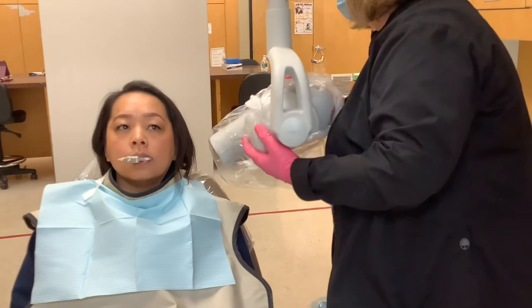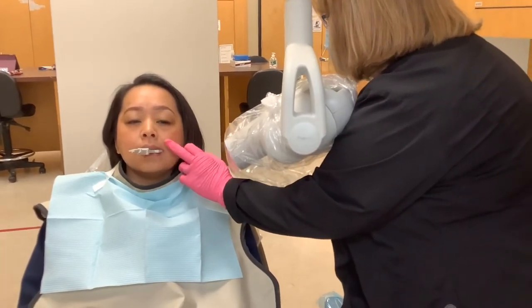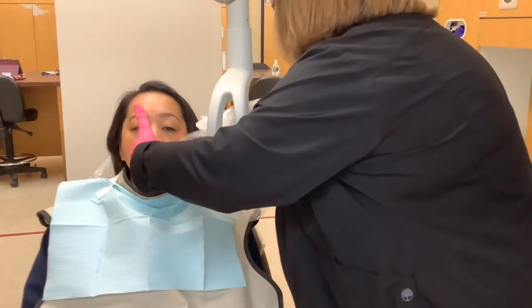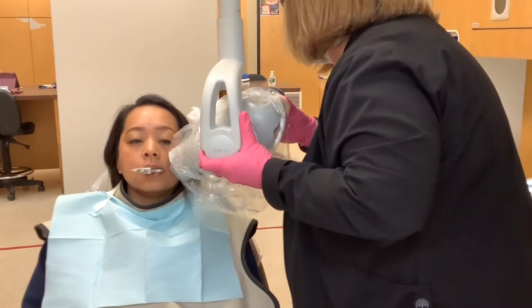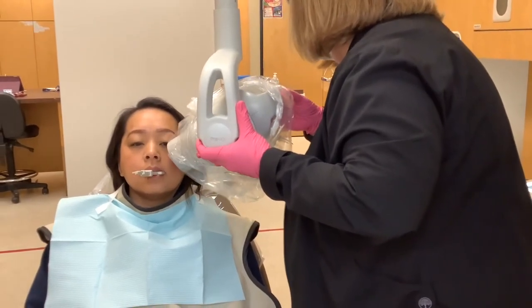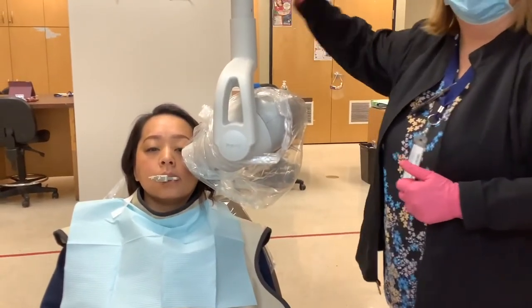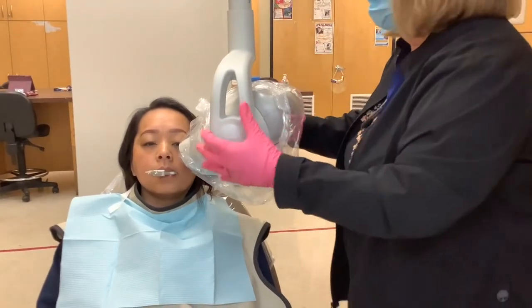I'm at 30. Find me a contact point — it's right here. My film is right there at this angle. I'm coming up, I'm at 30. How's my beam coming out? It's coming out right over the film — hit my button, there's my shot.